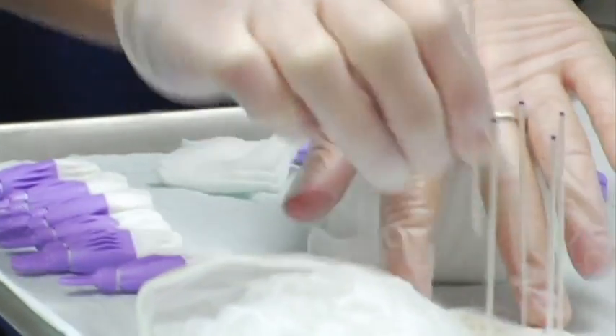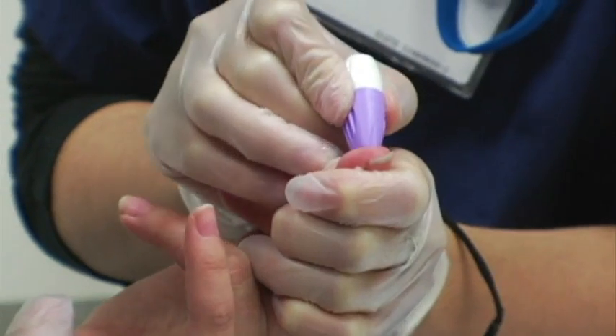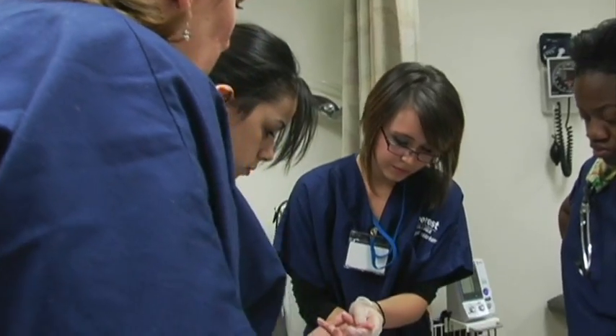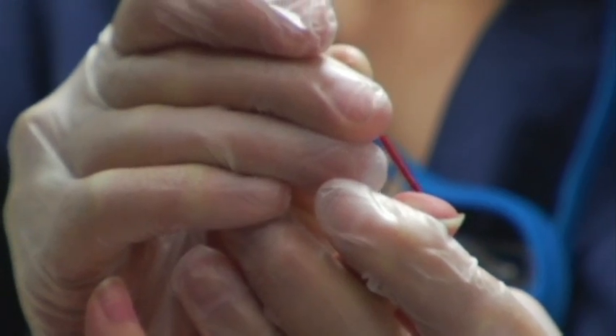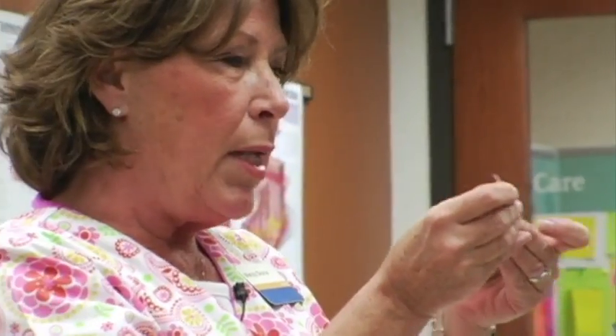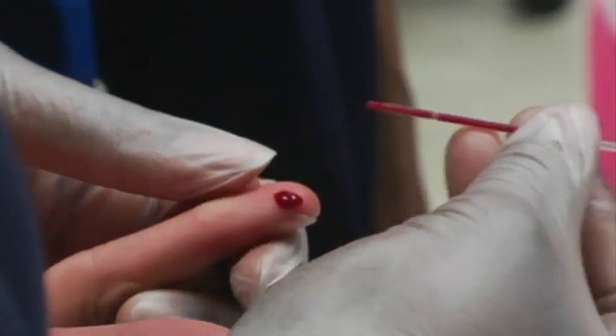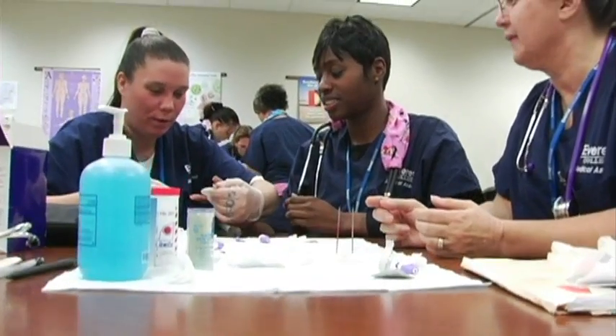You're going to alcohol off on the side, and what happens is you turn the top to pull it off, you stick your patient, you wipe off the first dot. You will take your capillary tube, making sure you have a ball of blood before you apply the capillary tube, because you cannot have bubbles in this tube. Once you get a full capillary tube without bubbles in it, you can do any finger stick test that they have out there.